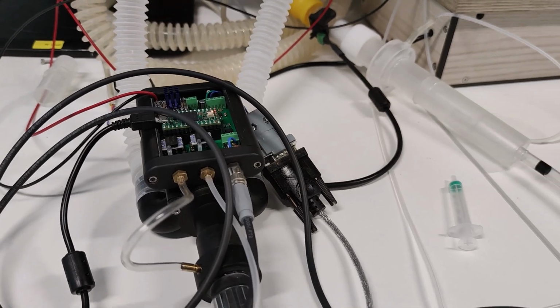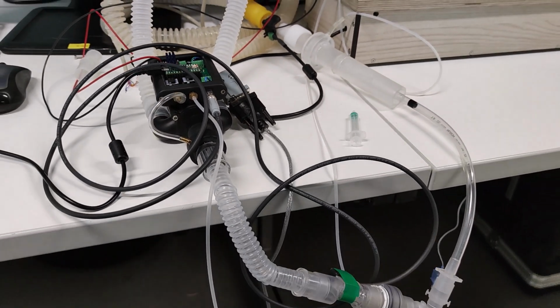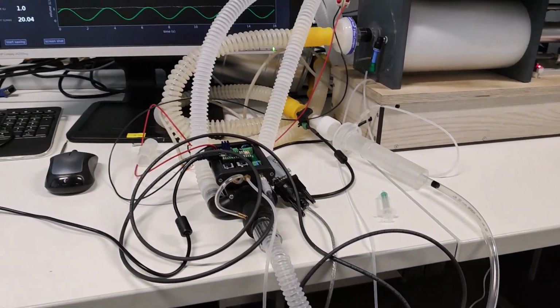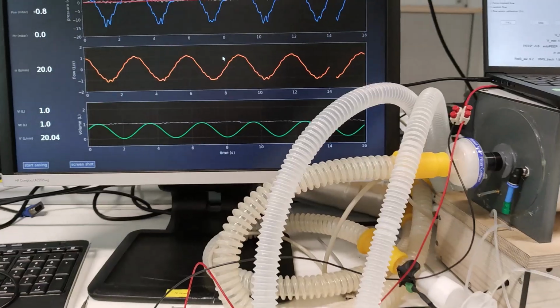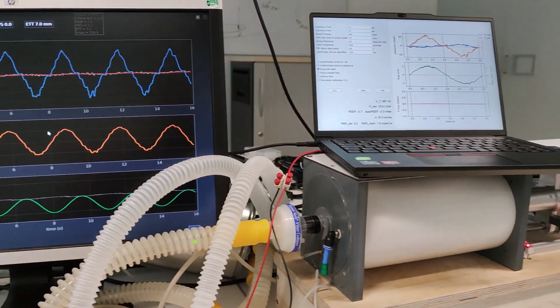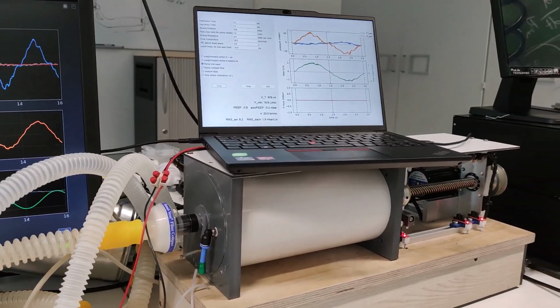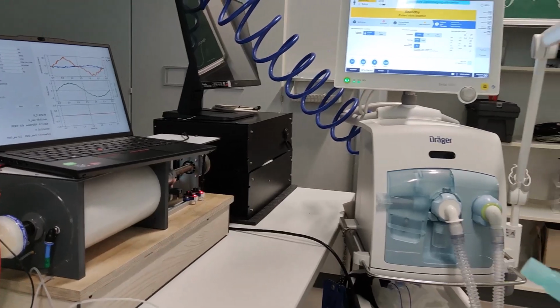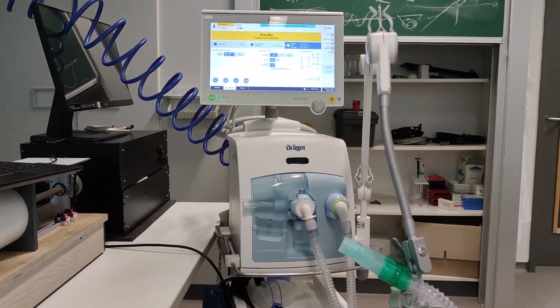Today I want to test my self-made 3D printed ATC ventilator. The ventilator is connected via a 7mm endotracheal tube and an artificial trachea to a lung simulator. This is the user interface for the ventilator. This is the lung simulator. And we also want to compare our ventilator with a commercial Dräger V600 ventilator.